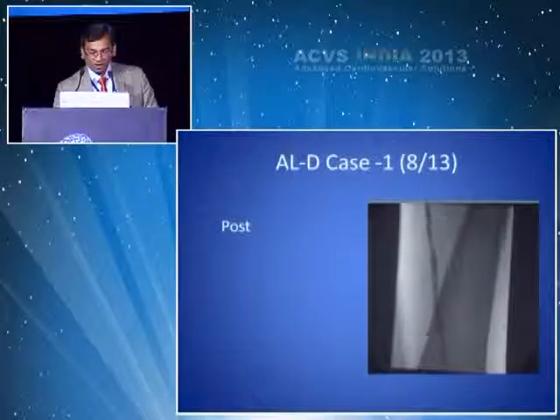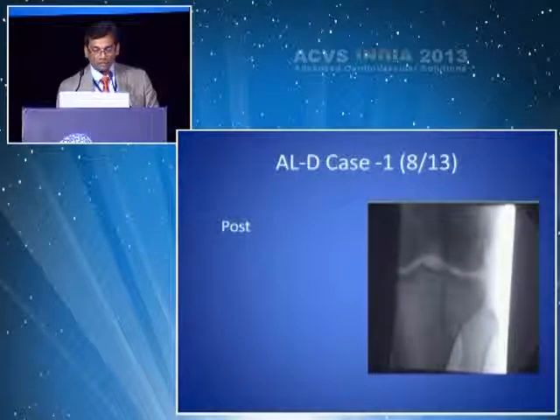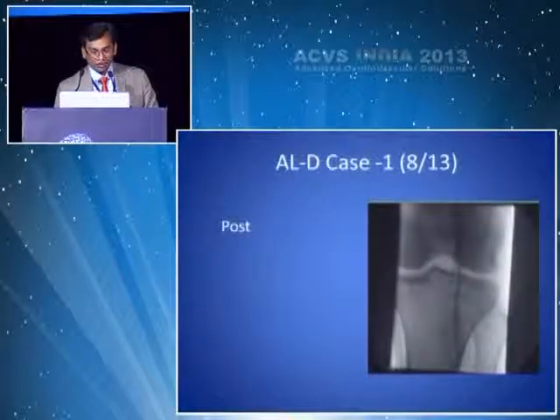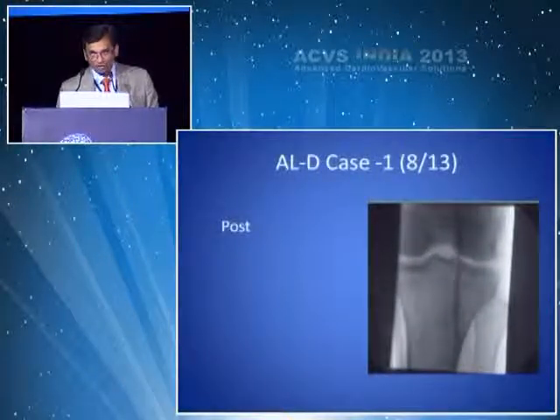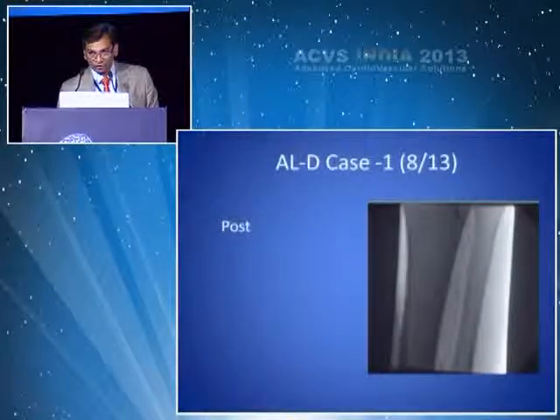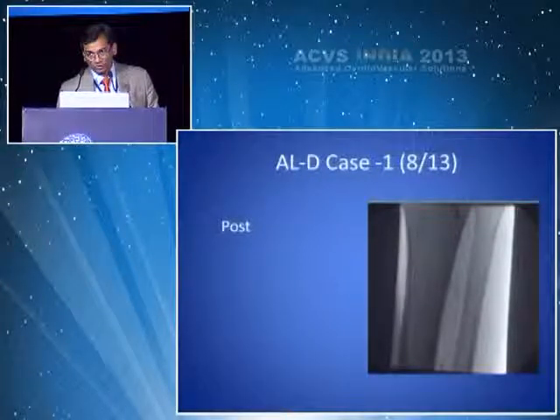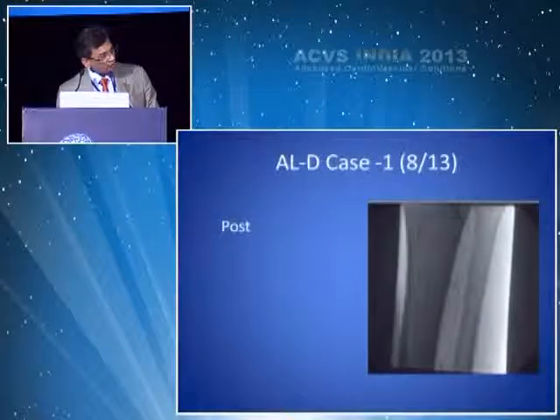So this is after multiple passes achieving optimal atherectomy. Then there's popliteal disease. Again, stenting or ballooning in distal SFA and below, I believe, is a waste of time in peripheral vascular disease. If you can't atherectomize and debulk them, you should just bypass them. There are alternate modalities that we use at our institute, which are end-diastolic compression treatments that improve neorevascularization, which is a better approach.